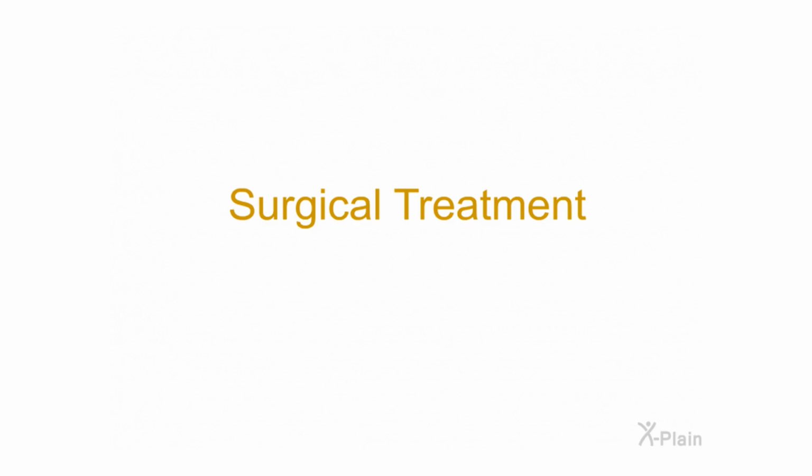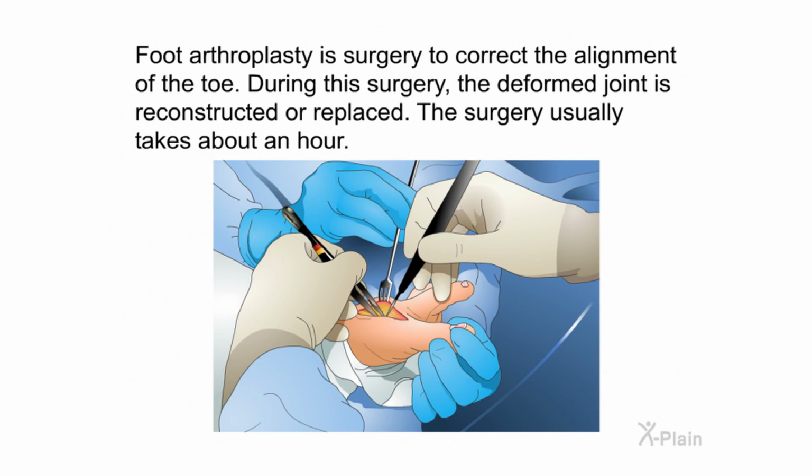Surgical treatment. Foot arthroplasty is surgery to correct the alignment of the toe. During this surgery, the deformed joint is reconstructed or replaced. The surgery usually takes about an hour.